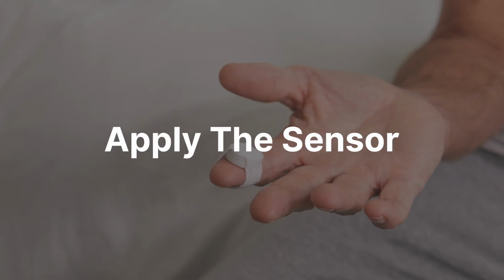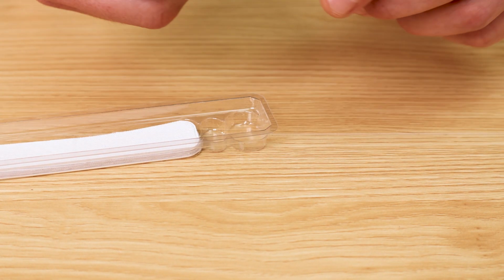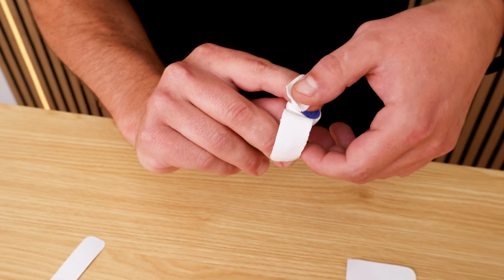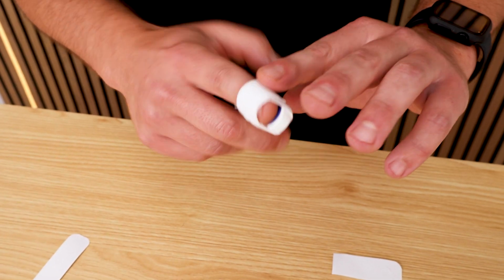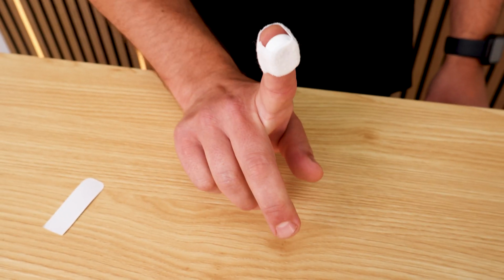Step 3. Apply the sensor. Now let's set up the sensor. Take the NightOwl device and locate the blue side. That's the side that should face your skin. Place it on your left pointer finger. Use one of the white adhesive strips to gently wrap the sensor around your finger, snug but not too tight. Remember, the finger sensor is completely painless and you'll barely even notice it during the night.